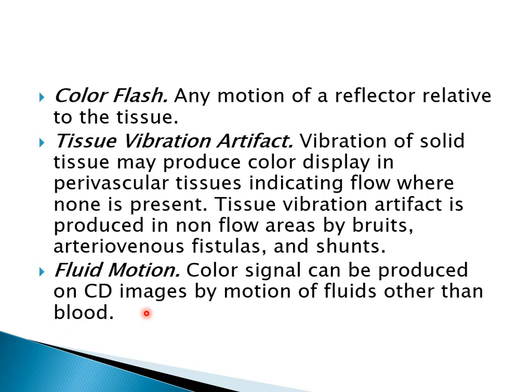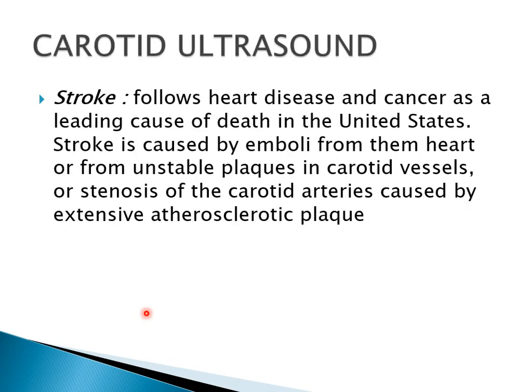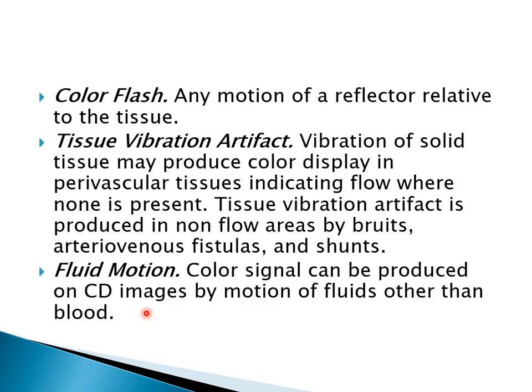You need to have your hand fixed, the tissue fixed, the patient fixed, everything not moving, only the blood moving. Only the blood. So that you get a good color Doppler image. Any movement will produce colors: movement of your hand, movement of the patient, movement of the tissue, for any reason, you'll have noise, which is artifacts, because you need everything to be steady, so you can see the moving blood.